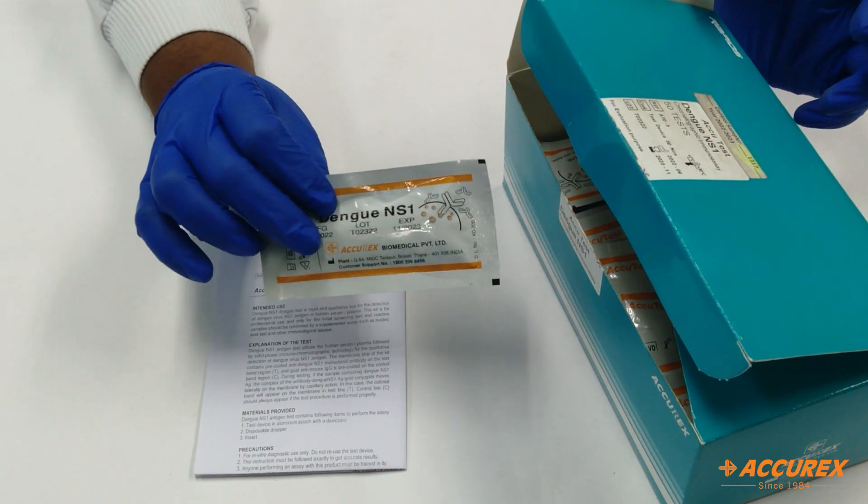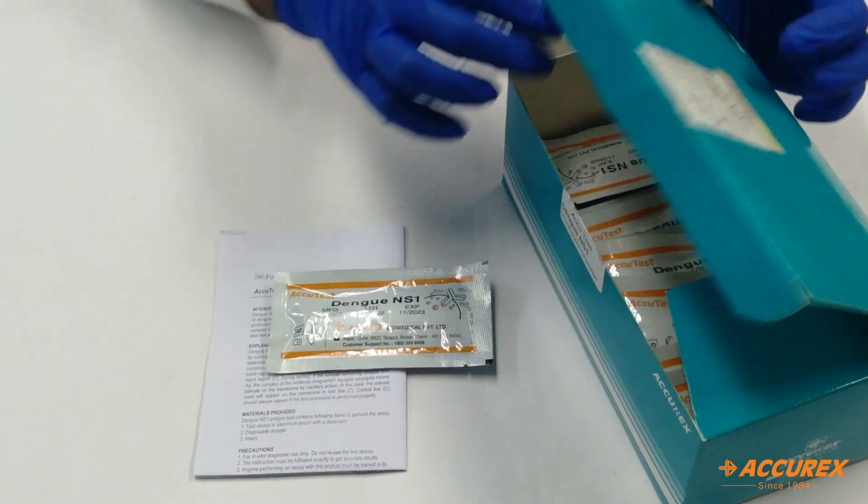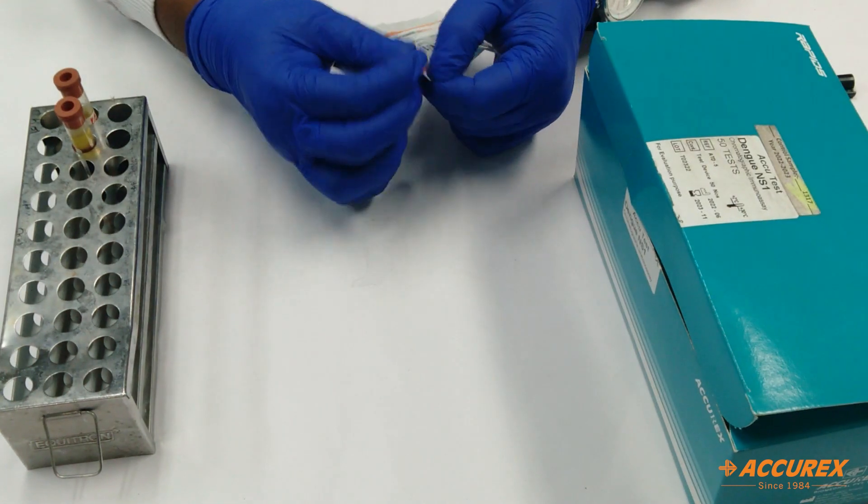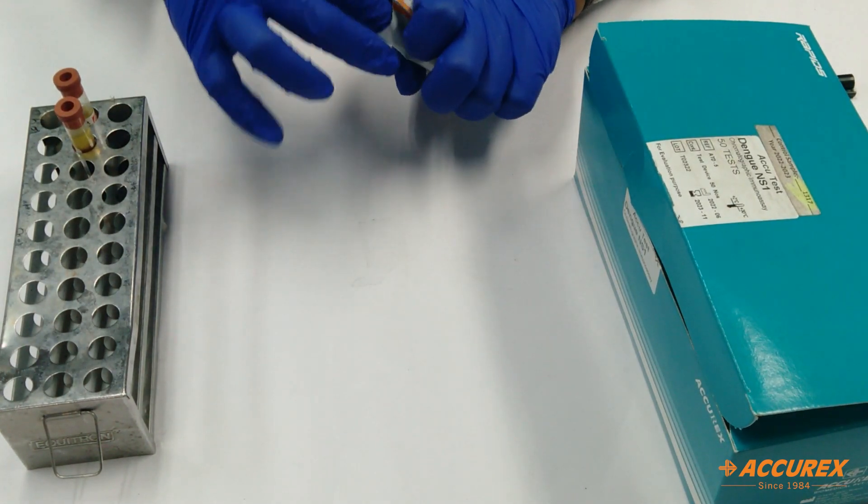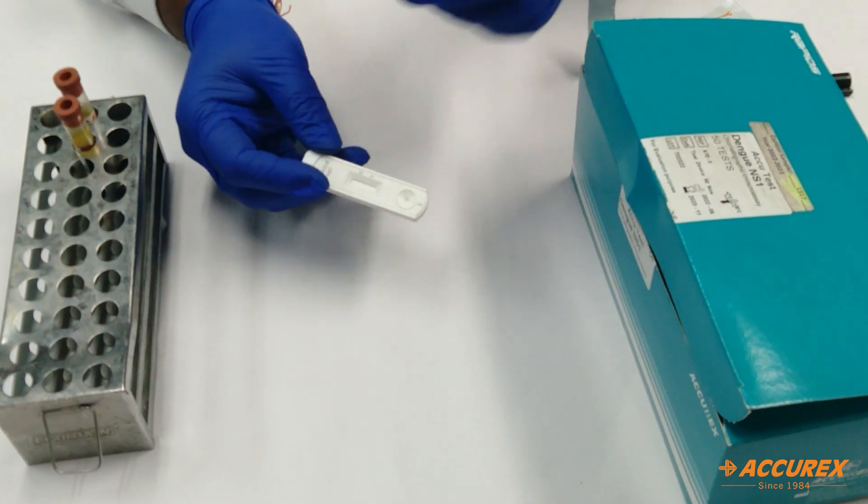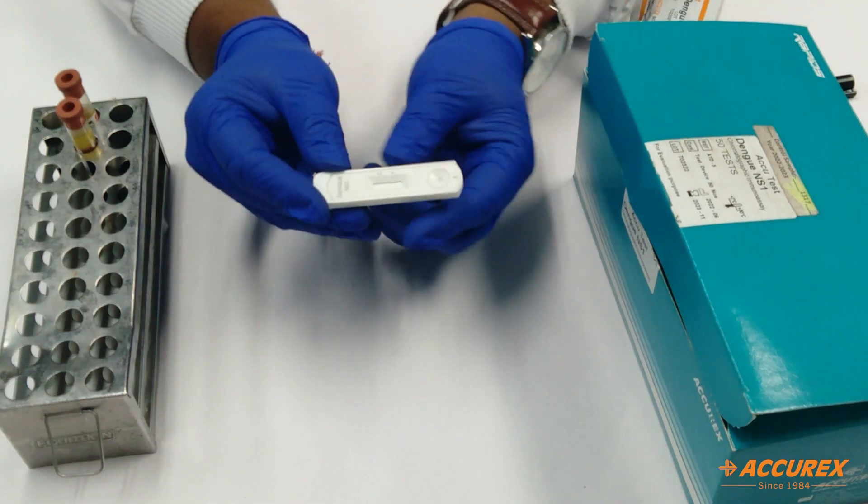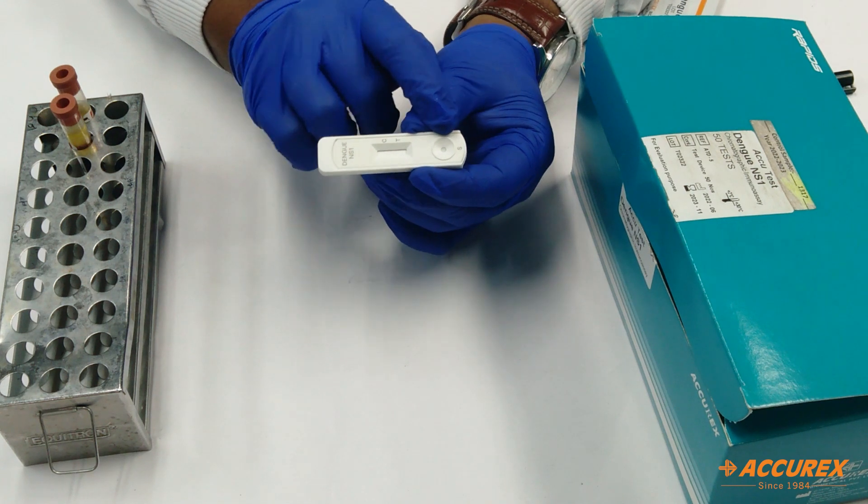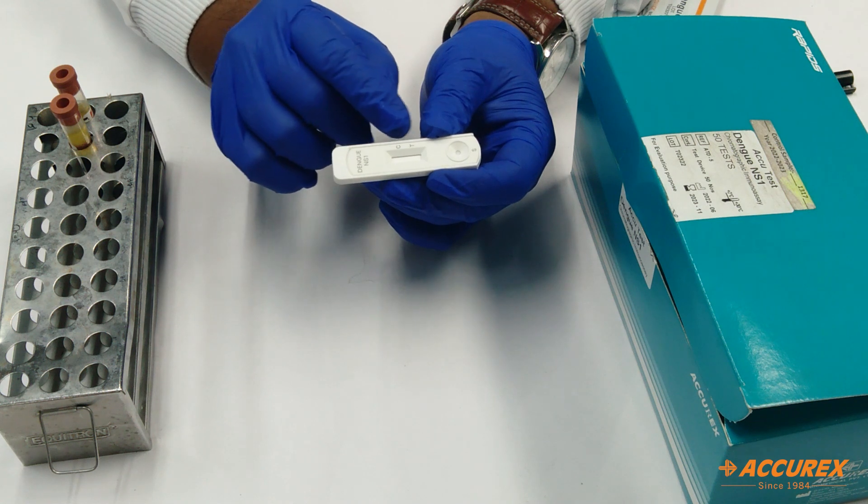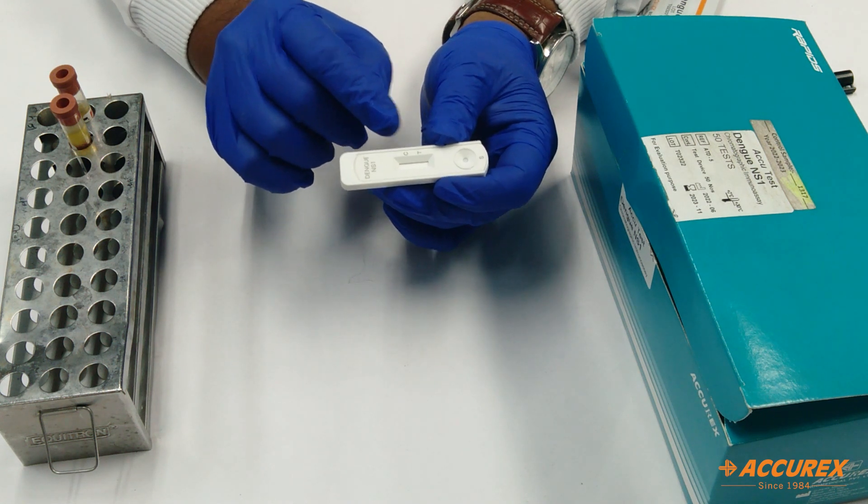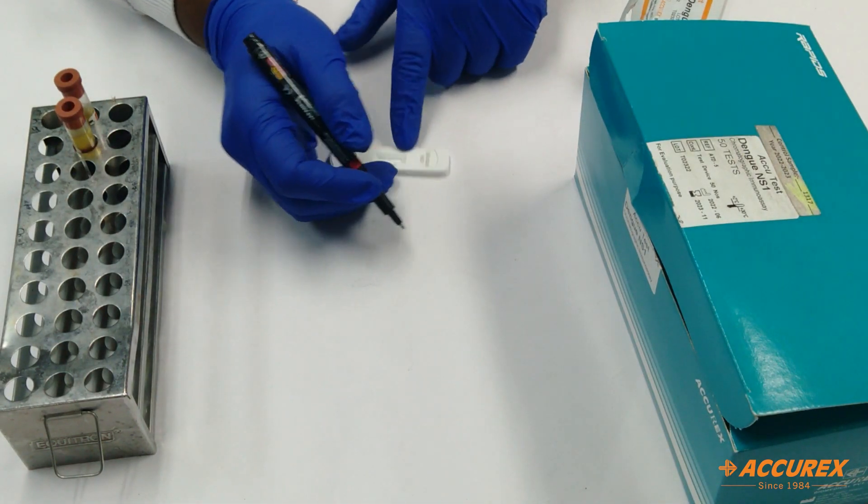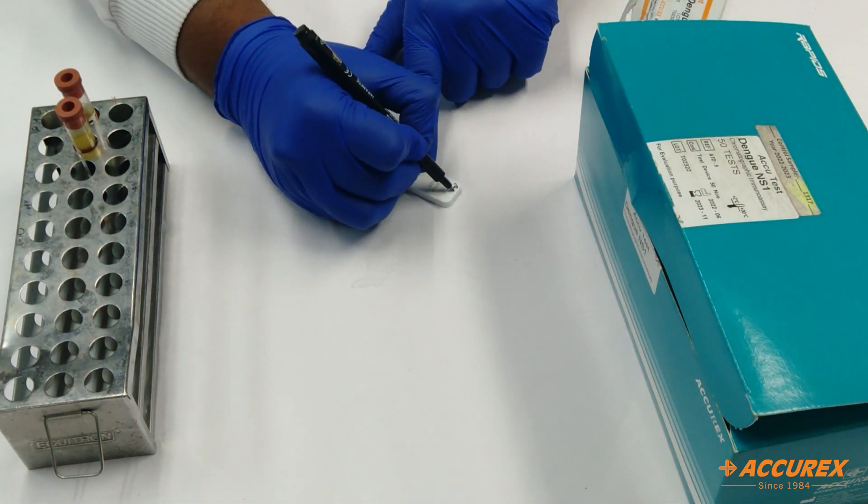Now we'll proceed to the testing part. Inside the pouch, you will find the test card and one dropper. On the test card, you will see the sample well where you need to put the sample. You can also find the lines showing control and test. Before processing, you need to mention the patient name on the card and the date.